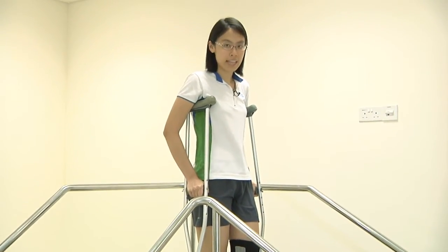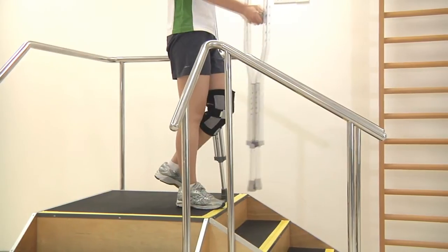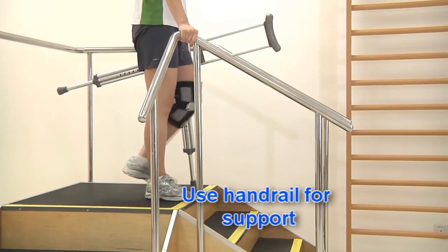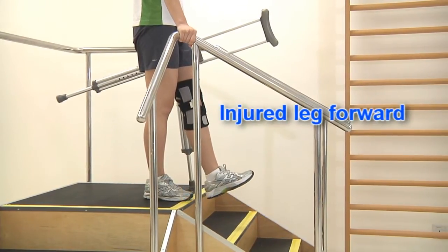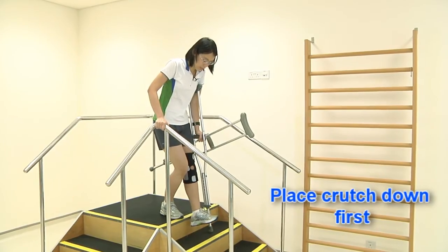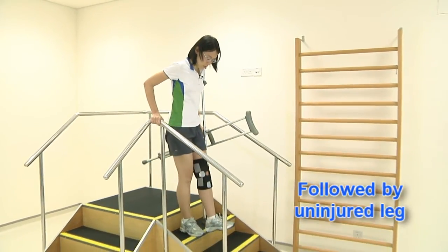To move down the stairs with a handrail, hold both crutches with one hand and the other hand on the handrail. Bring your injured leg forward. Crutch down on one step, followed by your non-injured leg.